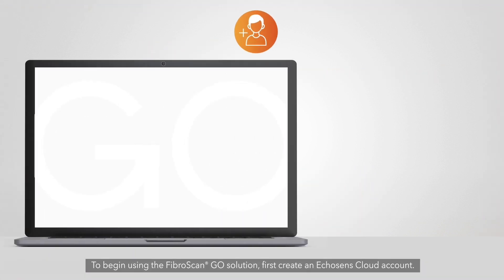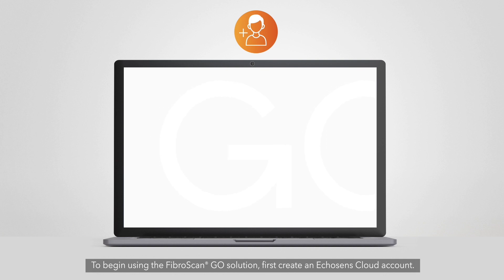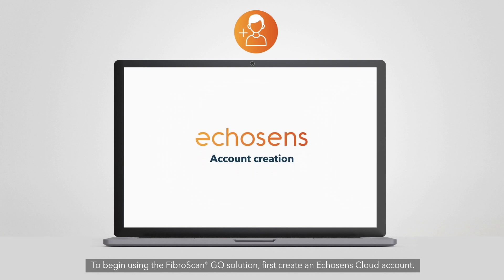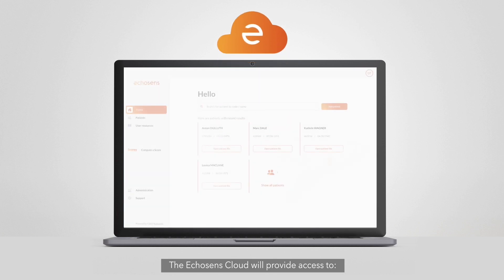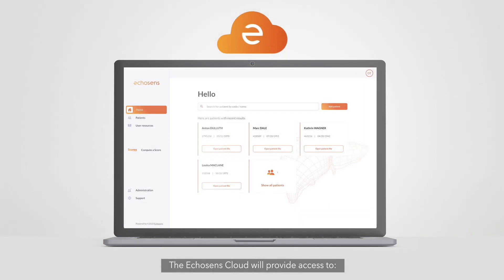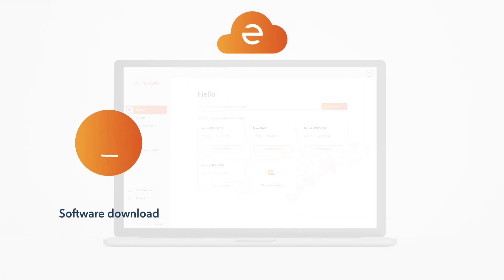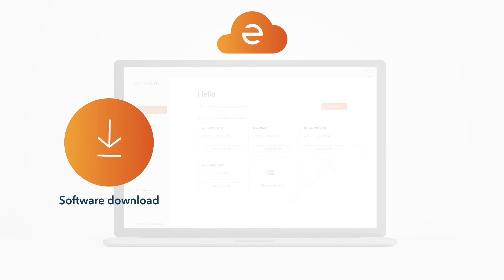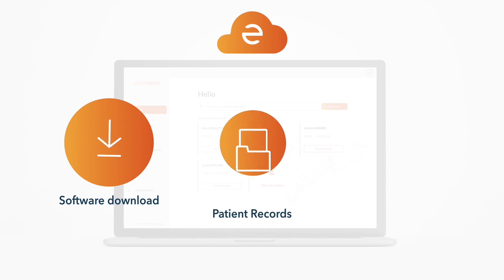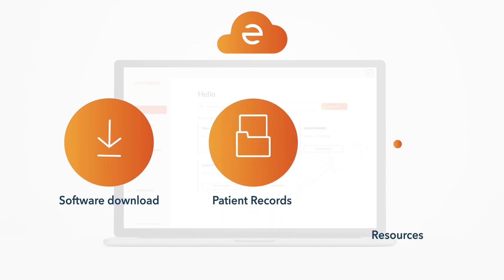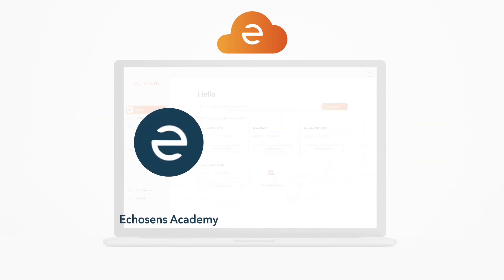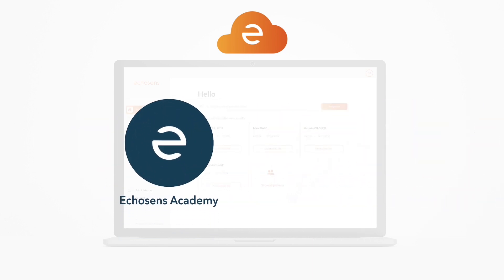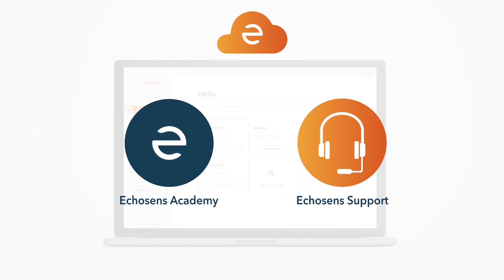To begin using the FibroScan Go solution, first create an Echosense cloud account. The Echosense cloud will provide access to the FibroScan application download, patient records, the resources section, the Echosense Academy with training resources, and Echosense support.